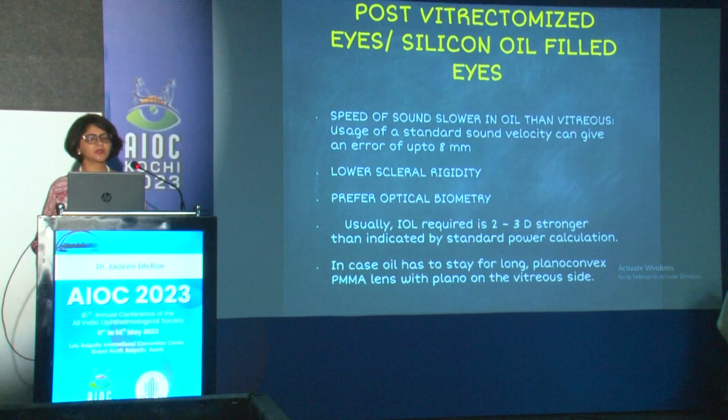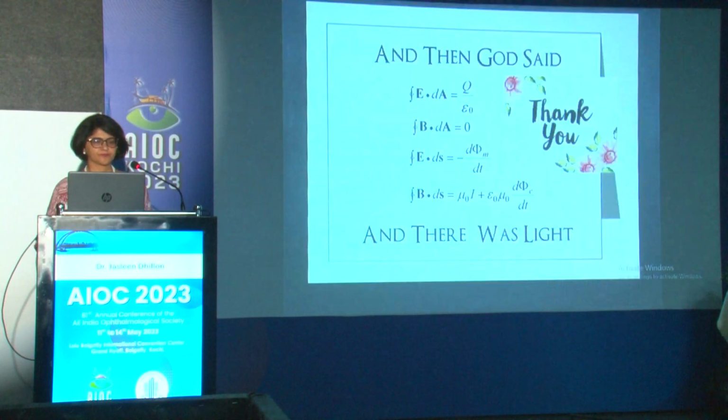And in silicone oil filled eyes, you need to see that the speed of sound is going to be affected, so there's an error if you do not modify the power. Usually the power required is 2 to 3 diopters stronger than the standard power. And I think I will just close it here. So use multiple readings, multiple formulae, optical biometers, and also check what the other eye is if it is pseudophakic.